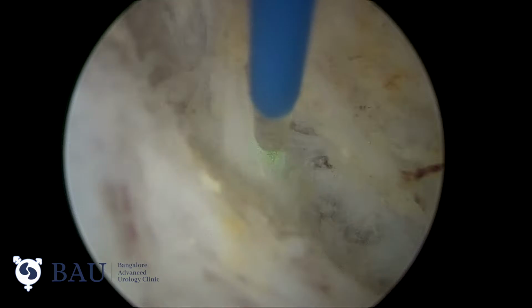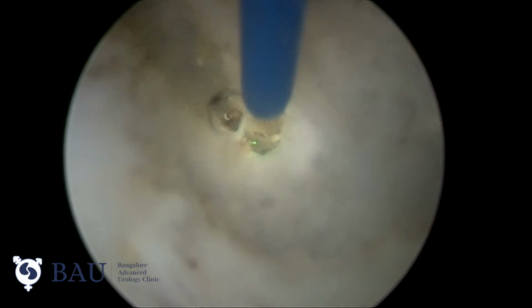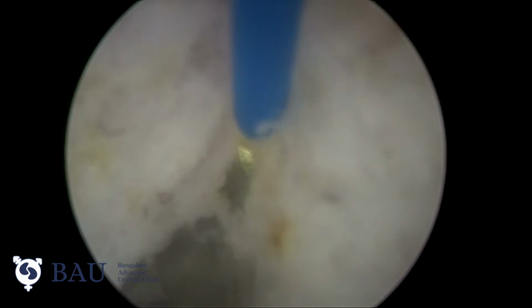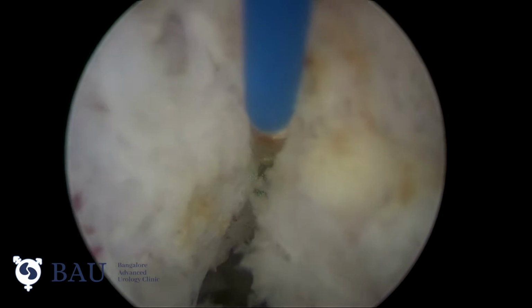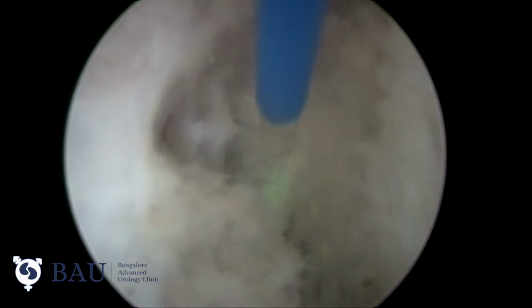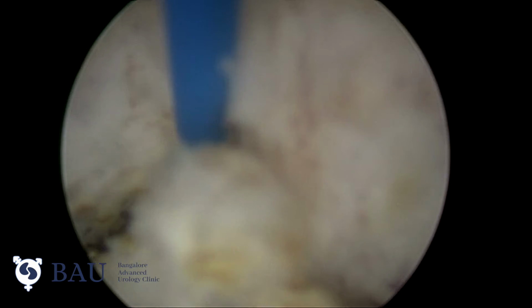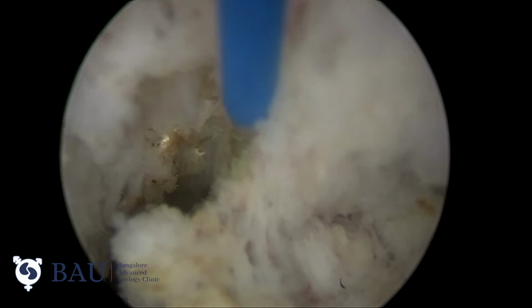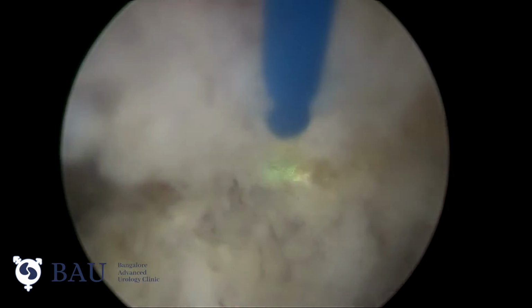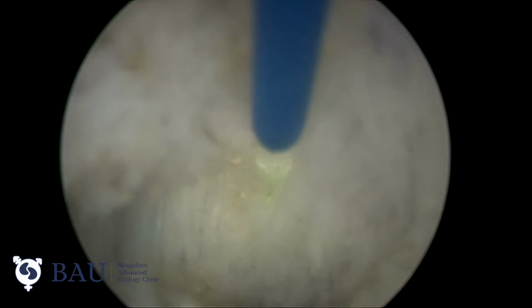Now we are rotating the laser fiber and proceeding with the lateral lobe on the right side. And most of the time this area is an easier plane to reach the bladder neck.